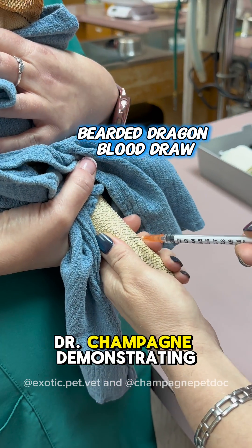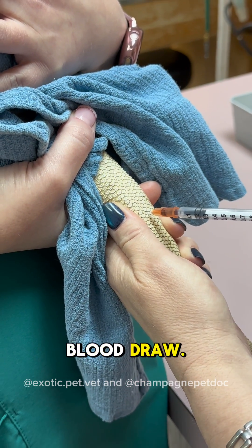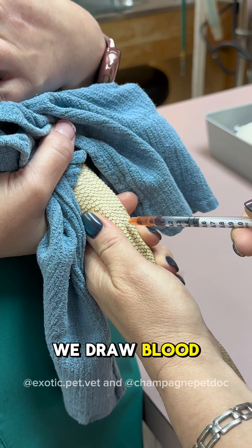Here you can see my coworker, Dr. Champagne, demonstrating a bearded dragon blood draw. In bearded dragons, we draw blood from their ventral tail vein.